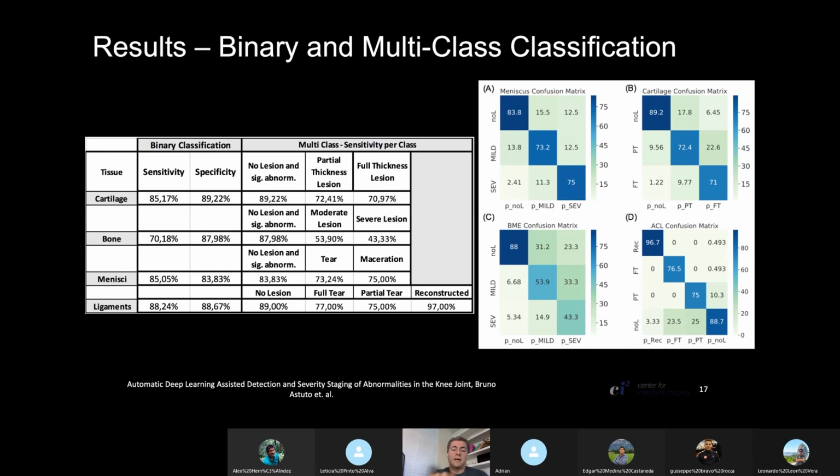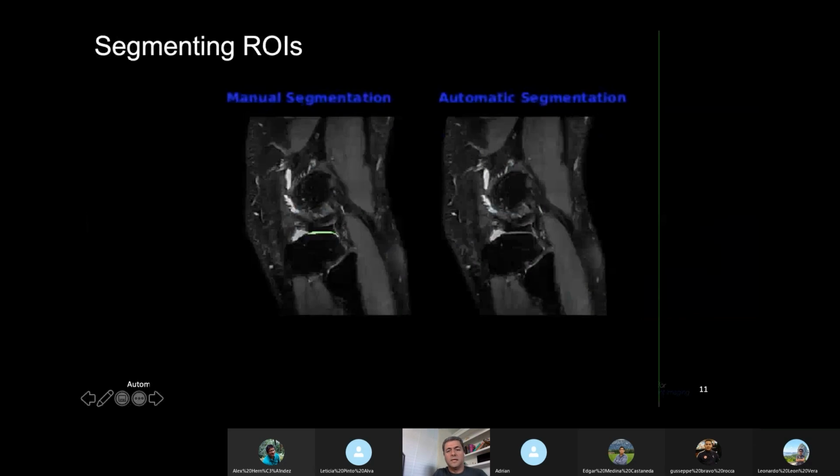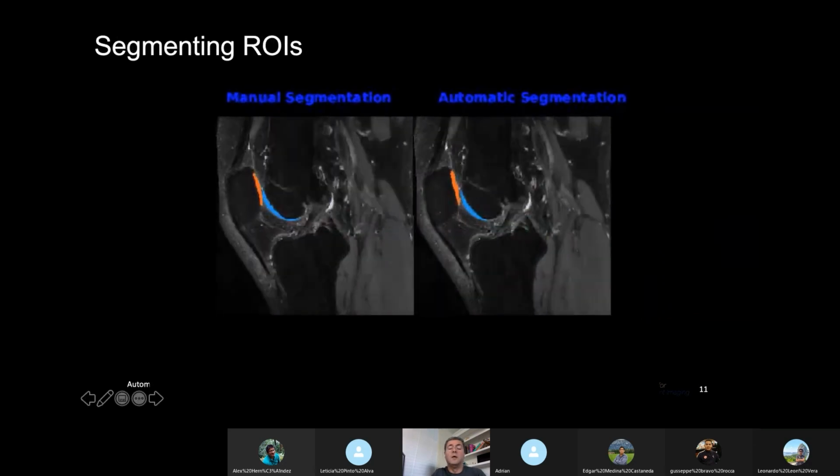I have similar numbers for the data sets collected in these two outside clinics. For the evaluation, they manually segmented some of these images, so we can compare the segmentations more closely. And this is one of these comparisons, for the segmentation model.